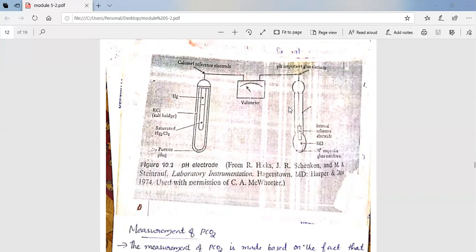The most common type of glass electrode used is the syringe electrode because it is convenient for taking samples of blood. While using the syringe electrode, the syringe should be rolled between the hands to ensure thorough mixing. Micro glass electrodes are preferred for pH monitoring in surgery, that is real-time monitoring. In situations where real-time monitoring is required, we use the micro glass electrode.